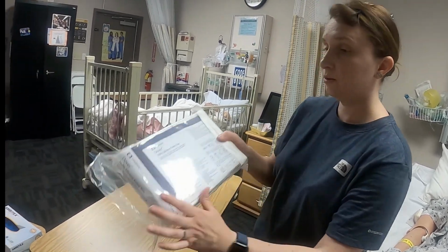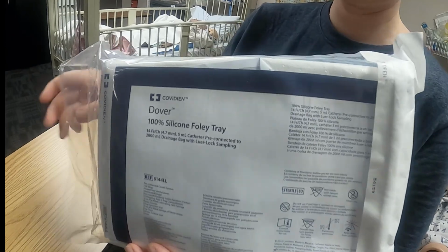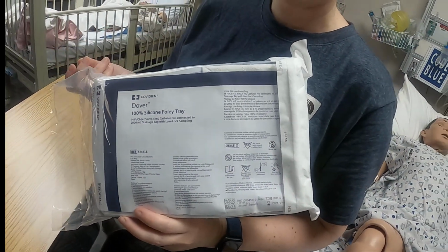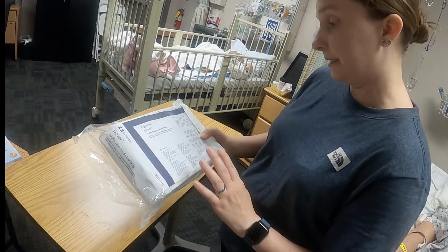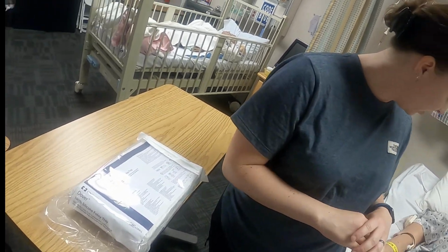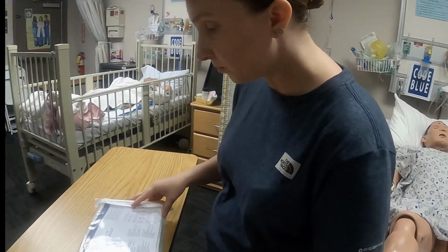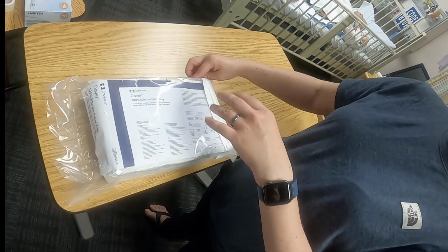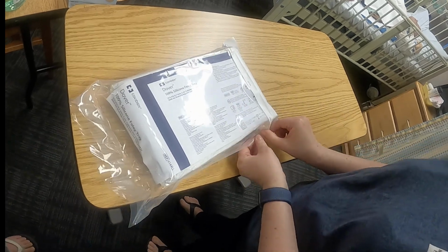Okay, so I do have a nice complete tray in there, and it has everything in it. We make sure that he's not allergic to iodine or anything. And Mr. Patchett here, he doesn't have any allergies. Okay, Mr. Patchett, are you allergic to anything? No? Okay, wonderful. Okay, so let's go ahead and unwrap everything. I also brought myself an extra set of non-latex sterile gloves just in case.